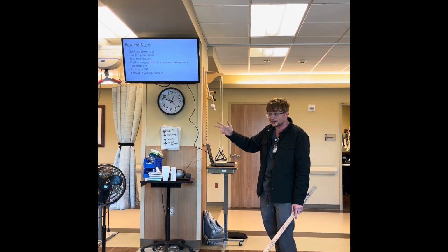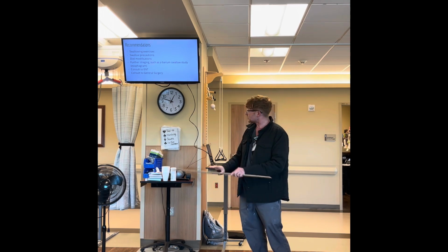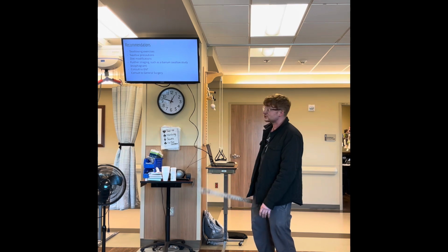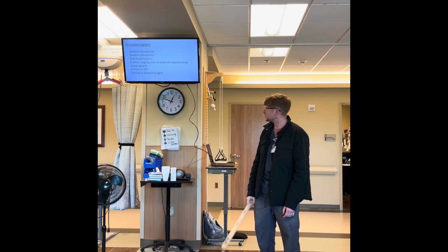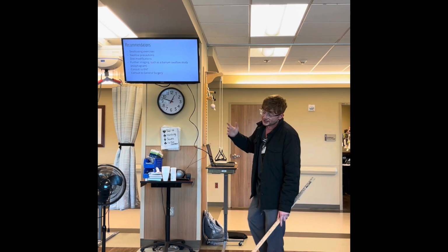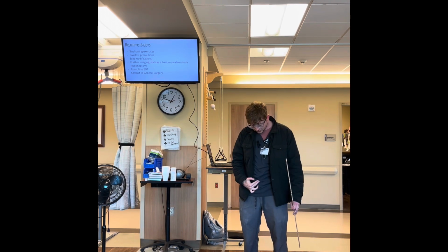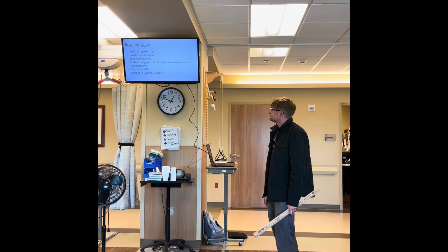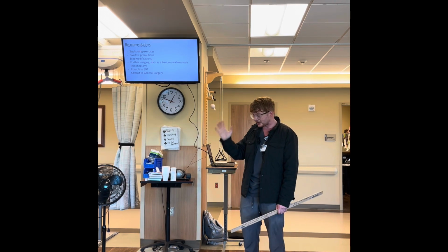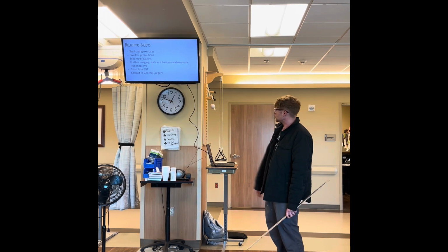Here's an example of what it's not. The Modified Barium Swallow Study is not the Barium Swallow Study. Those are oftentimes confused because they're almost the same name. I wish they'd find a way to change it, but I wouldn't know what to tell them to change it to. But the Barium Swallow Study, also known as an esophagram, that's when they come down, have them take a pill standing, and they get the whole look of their esophagus. And for that, there are its own qualifications that the patient needs to have to be a candidate for that one. But not to get those two confused.